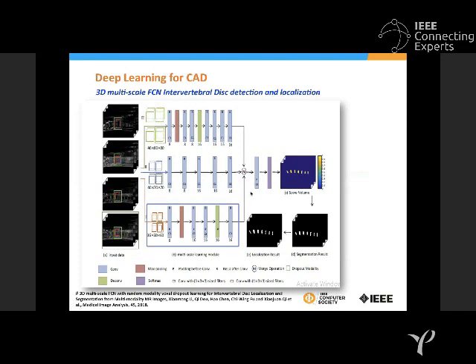So it inspects the images very thoroughly and in a multi-scale way, because if we did the analysis at a uniform scale, maybe the higher scale information or the lower scale information would get normalized.